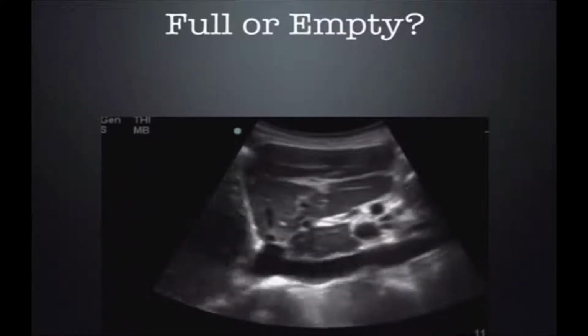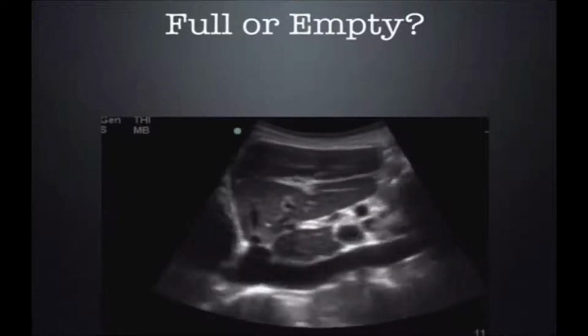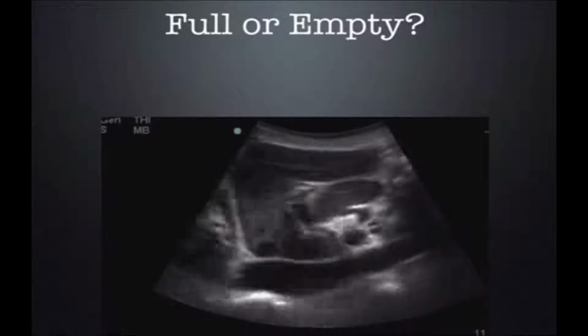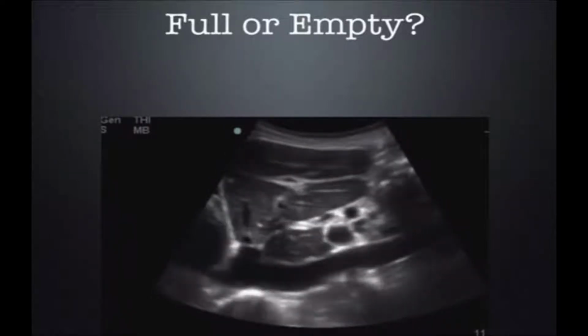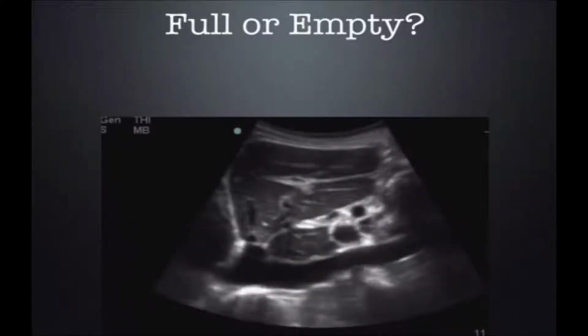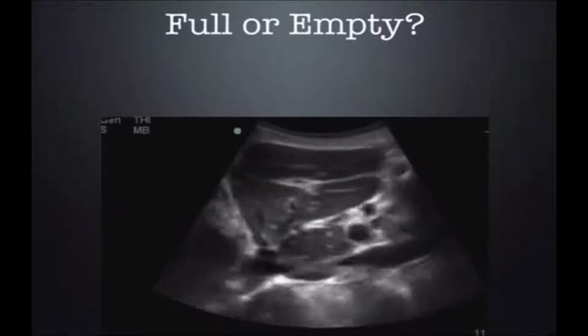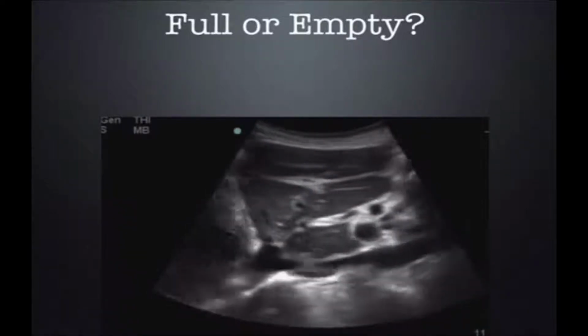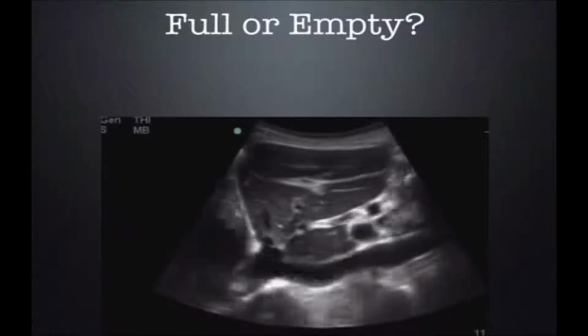In this case, just looking at it, doing a qualitative analysis, which is all you really need to do, I'm not an advocate of measuring the IVC and getting exact numbers. Just look at it and say it's approximately a 50% collapse with inspiration. What do we do with this IVC here?